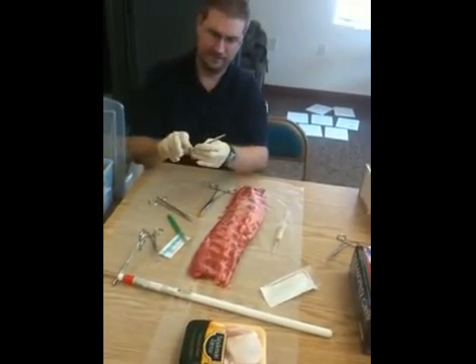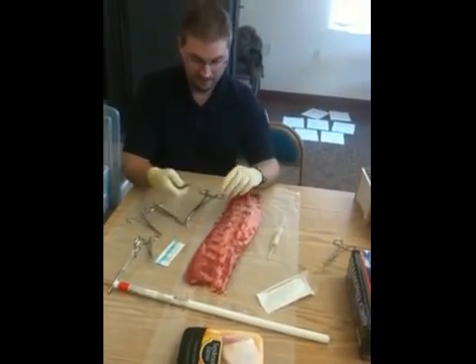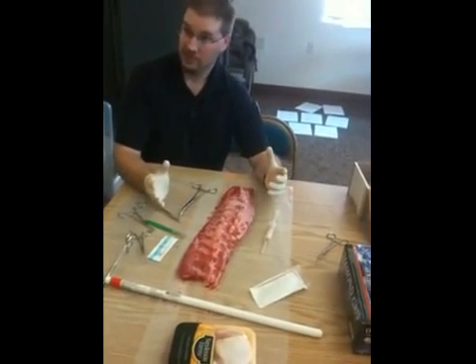You want a nice set of flat needle-driver forceps when you make your suture. Get that ready. Drape them up, scrub them up. You put on sterile gloves when you do this — you want to stay as sterile as possible.